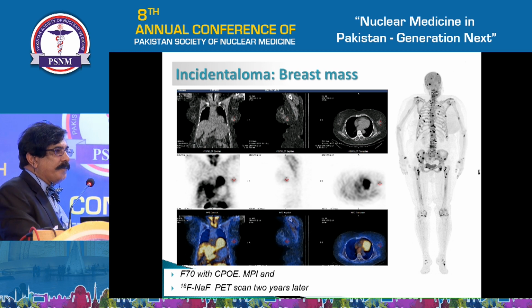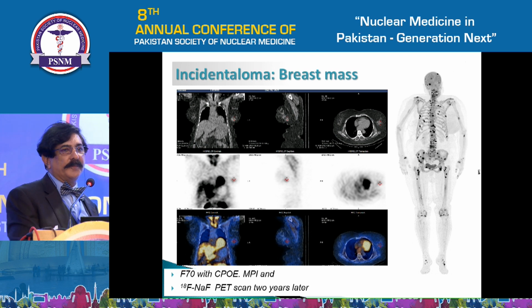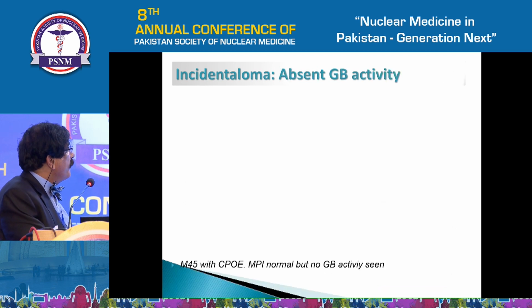So it is important to look, if you have done even a low quality CT, to look for something else that may be hidden there. It is done, it is there. It may be not diagnostic, but you may actually find something that is of importance.